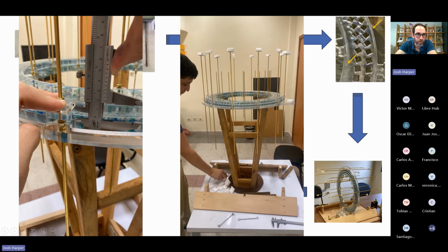And we use a specially designed tool and calipers to position them within 0.1 or 0.05 millimeters tolerance, based on whichever spec they have. So this one was a 20 millimeter distance ring. And we have to do this caliper measurement at every single brass rod that we have along the ring. So this is also another tedious and time-consuming process, but we know it works. We're able to produce good quality from this method.